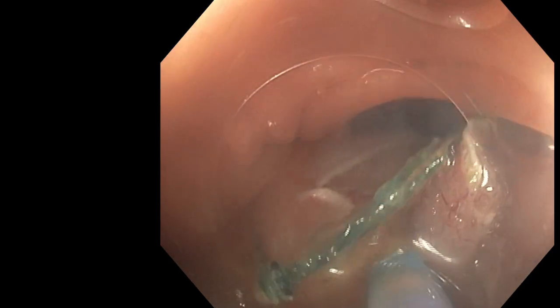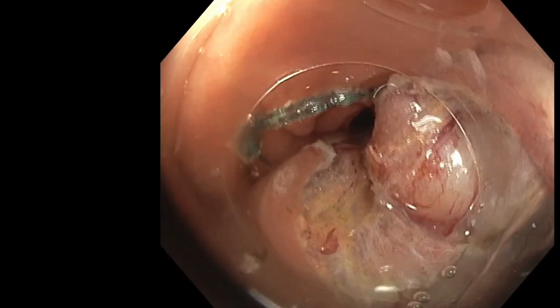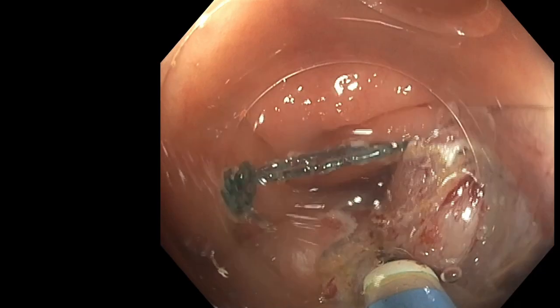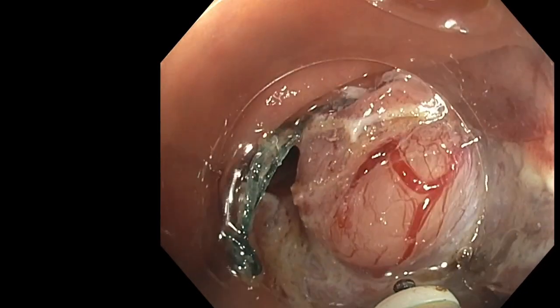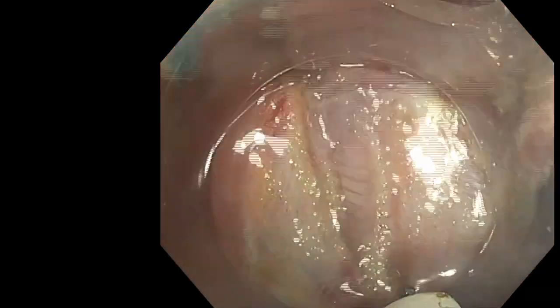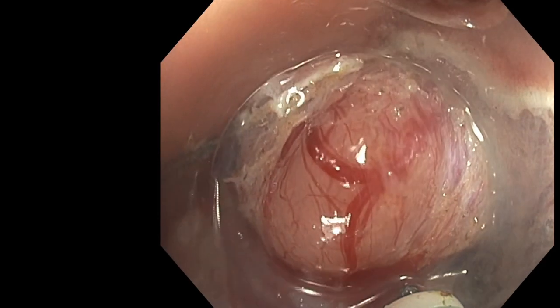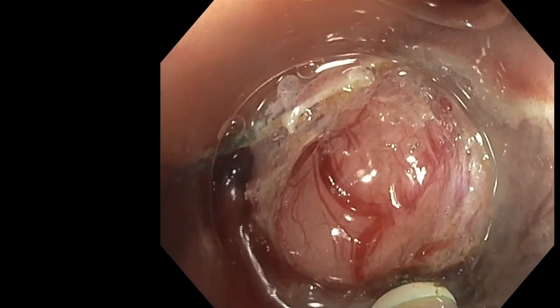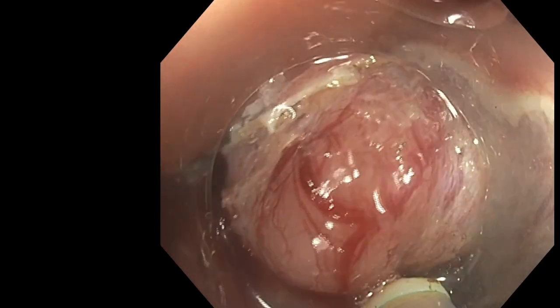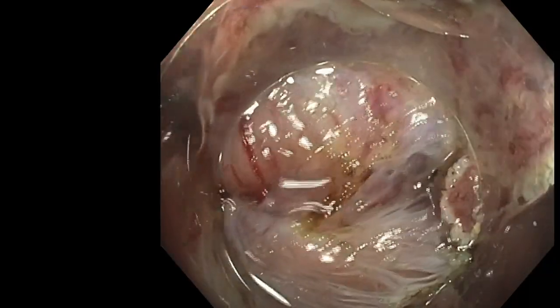If you don't remove the submucosa which is on the oral side of the diverticula, your traction is not only on the diverticular area, it's also in the normal submucosa at the oral edge of the diverticula, and if you have more fibers to tract, your traction force is less important than if you let only the diverticular area where you have all your traction force concentrated in the deepest area of the diverticula. So turning around is very important.